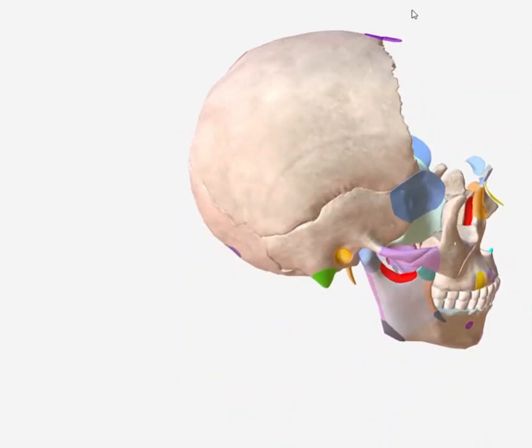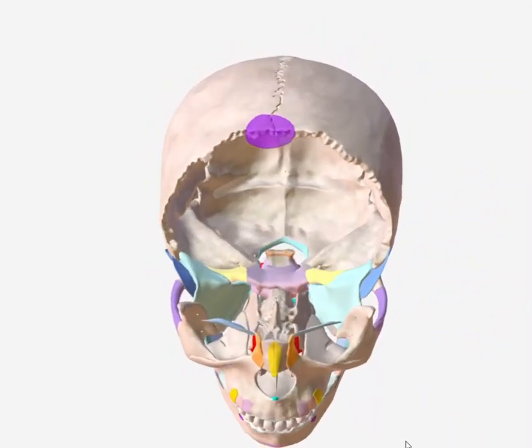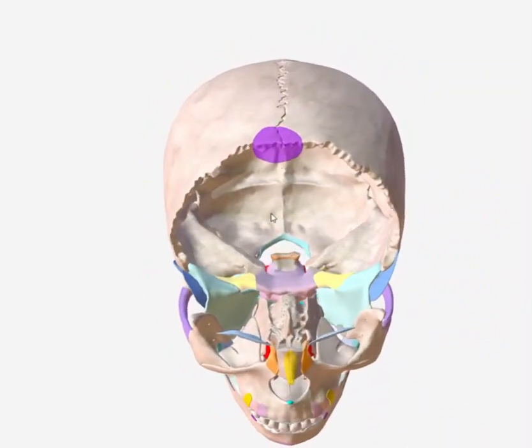We're going to take the central ray and hit it caudal, right? Hit the patient caudal from the frontal bone and project all of these anterior structures in a downward motion, leaving what's behind the face, which is the foramen magnum and the occipital bone, leaving it there so that the occipital bone and foramen magnum will be more superior.